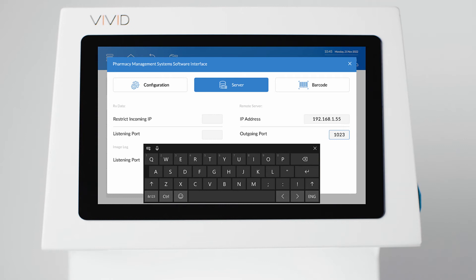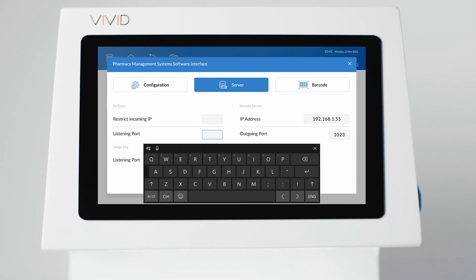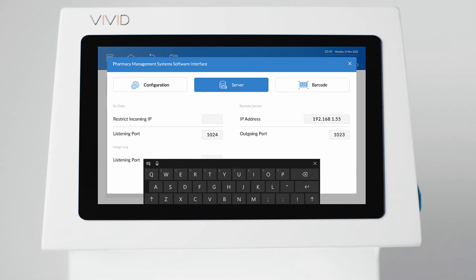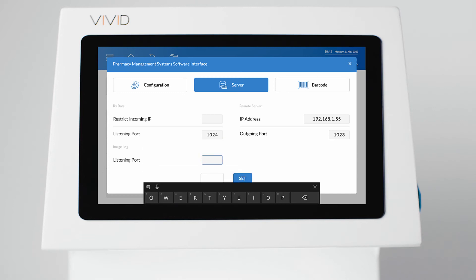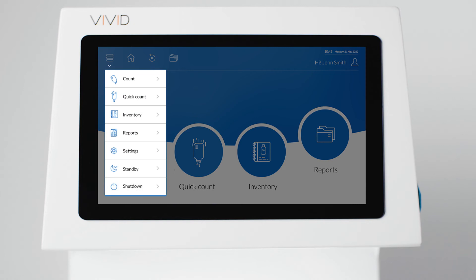Input the remote server IP address and outgoing port number of the computer or server that runs your software. You may have to ask your software provider for this information. Leave the Restrict Incoming IP field blank unless required by your software provider. Set the RxData listening port to 1024 and the Image Log listening port to 80. Be sure to press the Set button to save the settings.